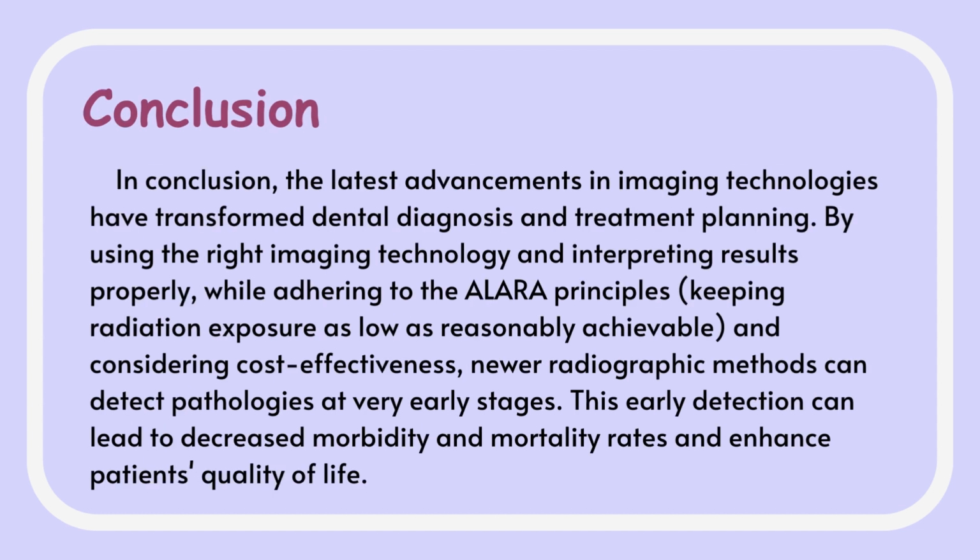So, in conclusion, the latest advancements in imaging technologies have transformed dental diagnosis and treatment planning, by using the right imaging technology and interpreting results properly while adhering to the ALARA principle, which is keeping the radiation exposure as low as reasonably achievable, and considering cost effectiveness. Newer radiographic methods can detect pathologies at a very early stage. This early detection can lead to decreased morbidity and mortality rates and enhance patients' quality of life.